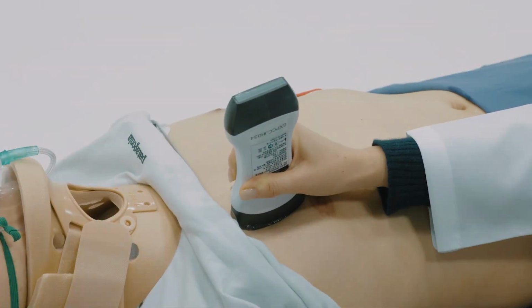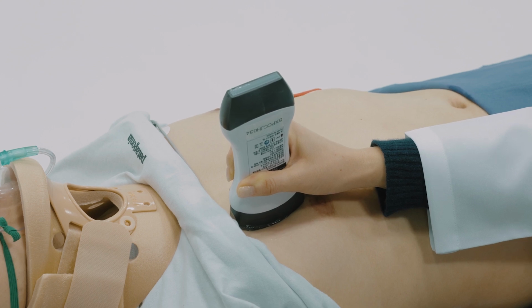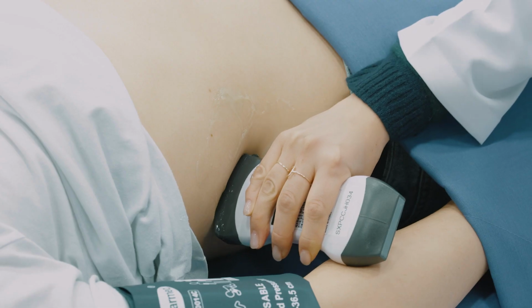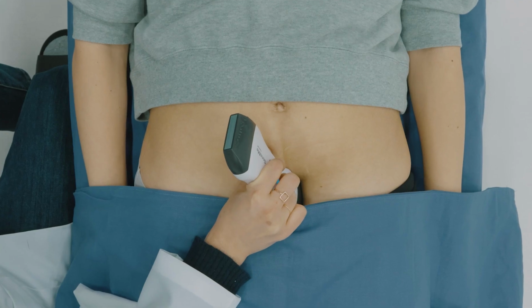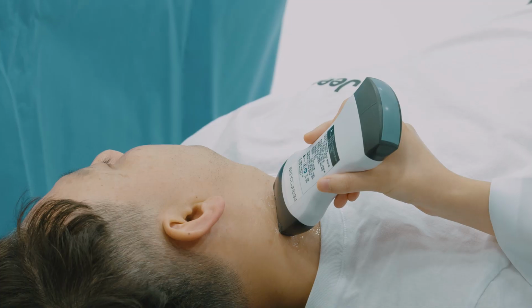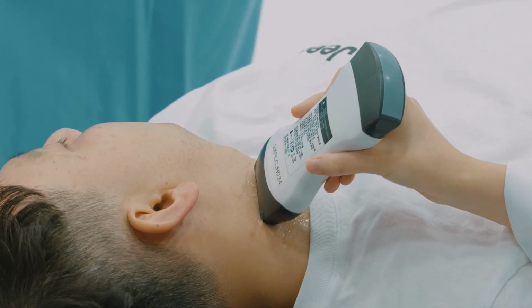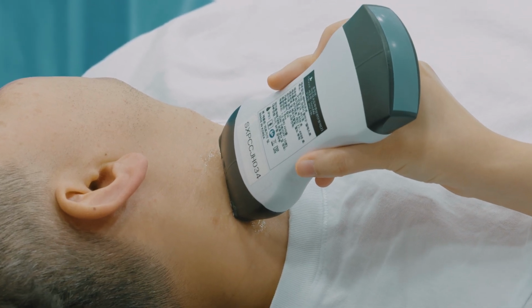eFAST is a vital ultrasound tool in trauma care, swiftly identifying fluid and pneumothorax for immediate decisions in unstable patients within the ATLS protocol. Despite its imperfections, it is crucial not only for early diagnosis, but also for continuous monitoring, enabling us to observe changes in a patient's condition in real time.